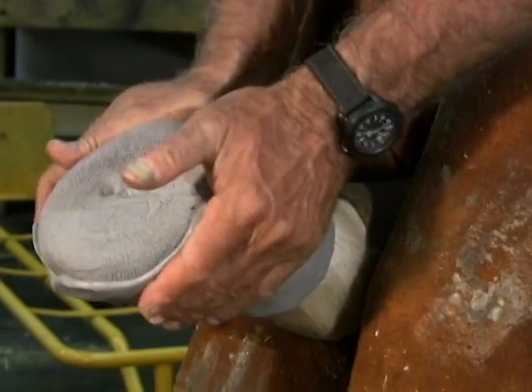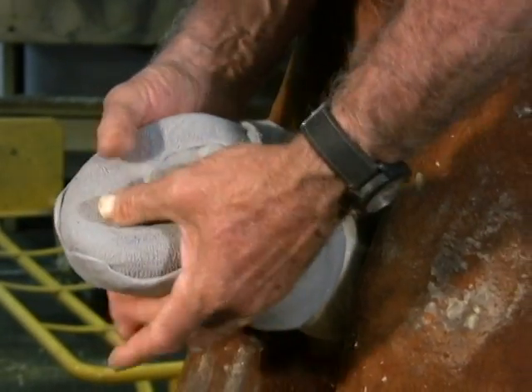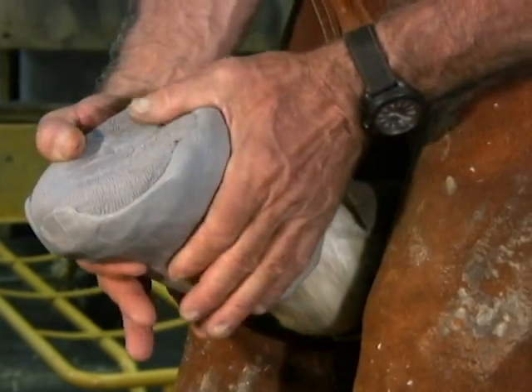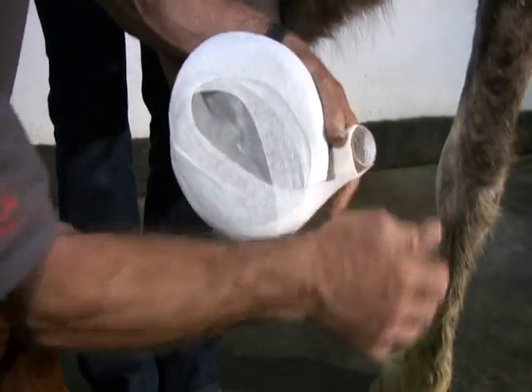While the first layer is curing, or after it is cured, place the second banana-shaped layer on the face of the foot, slightly overlapping the first layer. Wrap it around so it overlaps the heel. Use your finger and thumb to make good contact along the top of the first layer — you want a smooth transition, as any air space will show up in the positive mold. Once again, wrap the foot in vet wrap and use the heat gun to speed up curing.